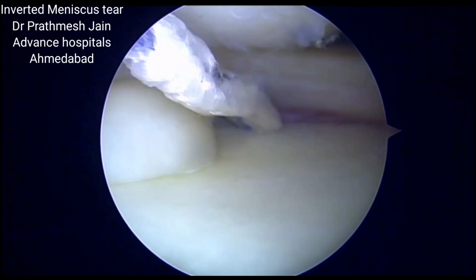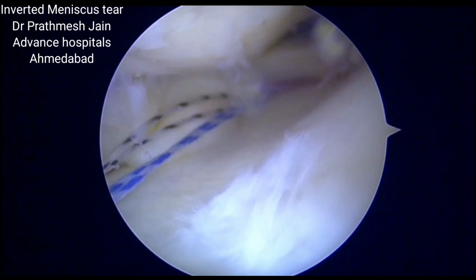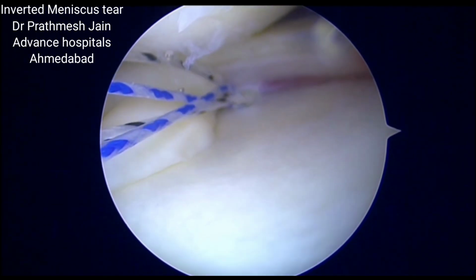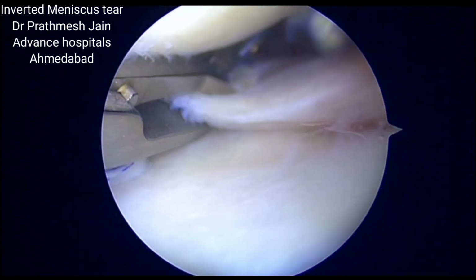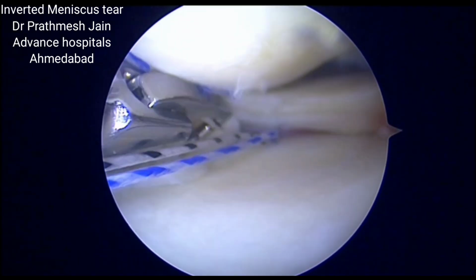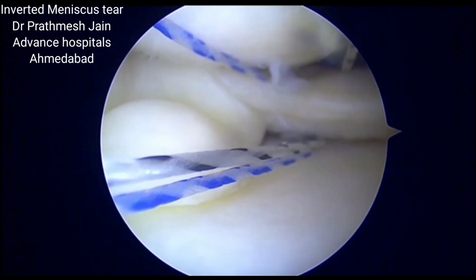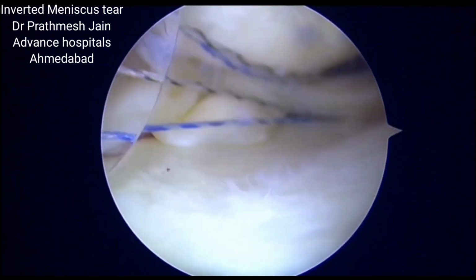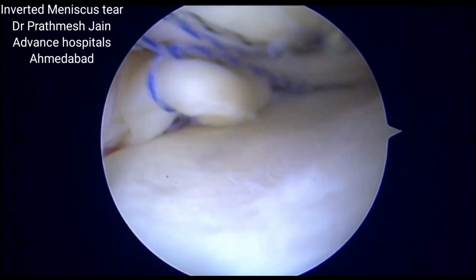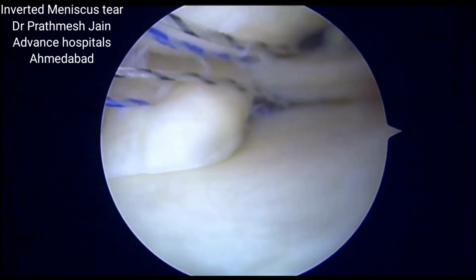The rootfix anchor is a retrograde anchor which is inserted into the knee, and this anchor can be used to repair these kinds of flap tears. What we do here is we repair the flaps of the meniscus one by one using knee scorpion instruments. We pass the sutures one by one and try to repair these tears in a side to side pattern. That gives us a lot of good repair techniques to restore the hoop stresses and to restore the alignment of the meniscus.